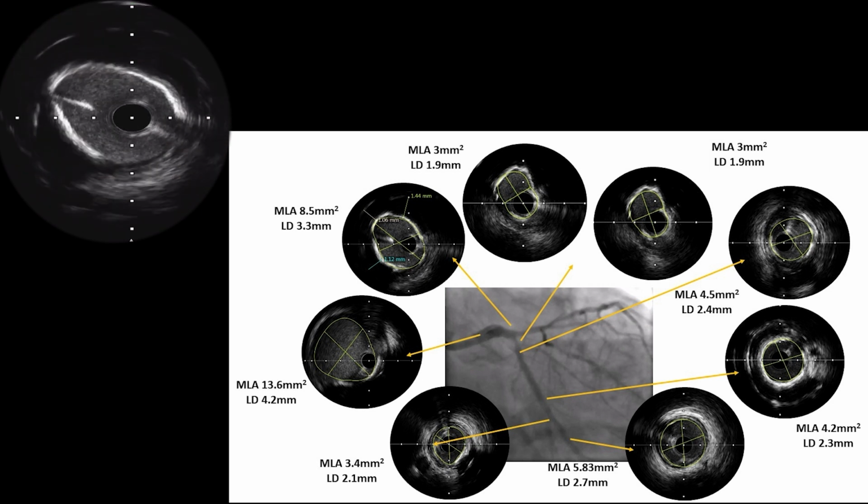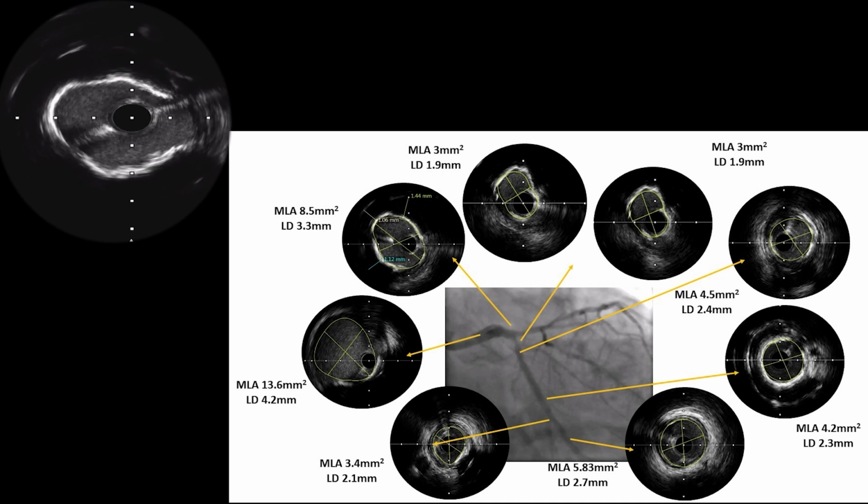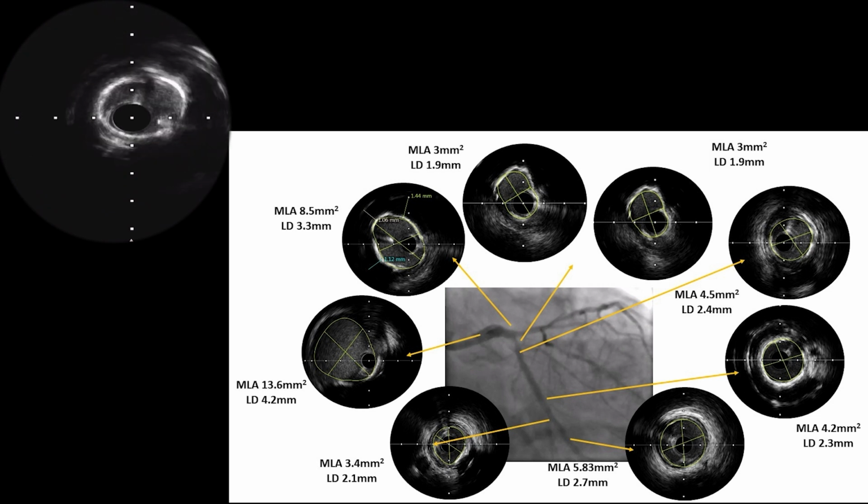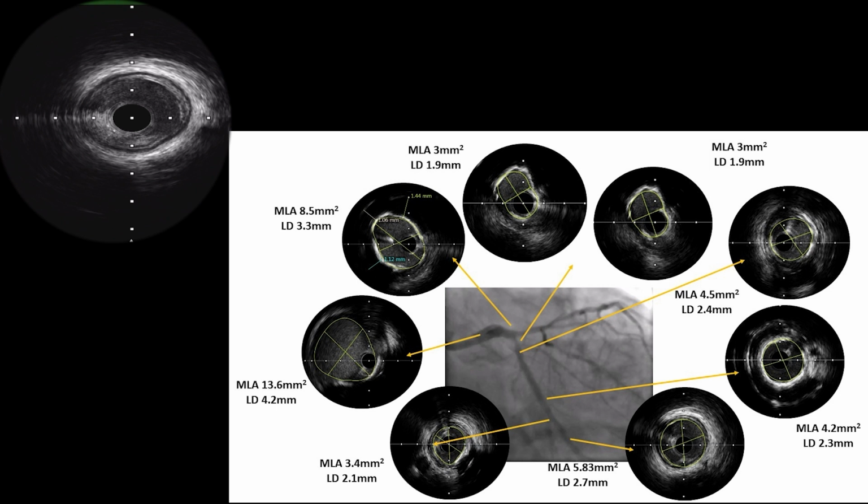Now I am pulling it to the left main. Left main also calcification is there. Almost a 300 degree calcium is there. Though distal LM and LAD are diseased, more importantly LCX ostium has significant calcium, and the previously stented segment is also diseased, and slightly distal to the stent also there is some disease.